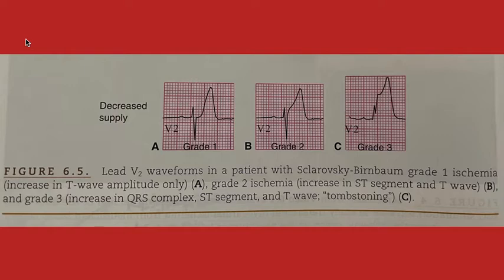This is crucial to not only us in the pre-hospital environment, but it's also crucial to our emergency medicine colleagues and our cardiovascular colleagues, because identification of grade 1 ischemia, as demonstrated by hyperacute T waves, addresses the culprit lesion at the earliest opportunity with excellent downstream prognosis for the patient. So essentially, this is the difference between leaving the hospital with significant left ventricular dysfunction and embarking on a new path of life in heart failure versus being discharged with full myocardial function intact.